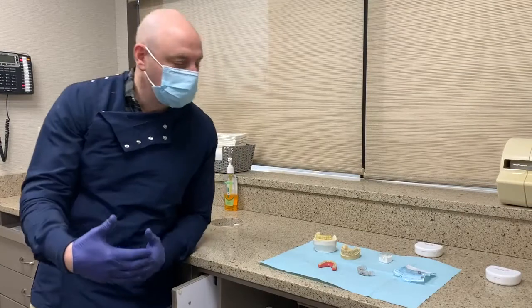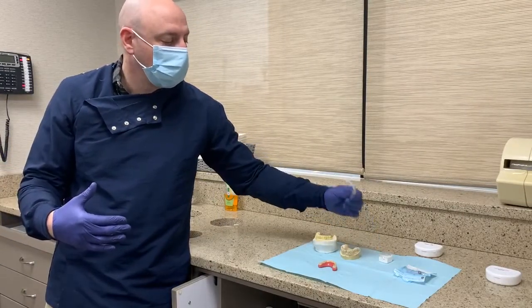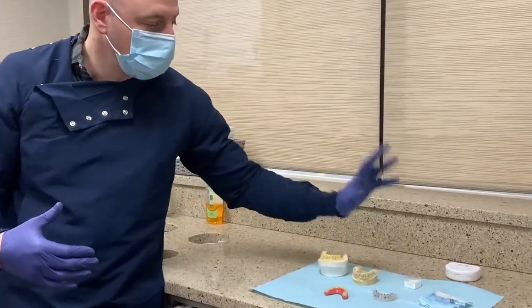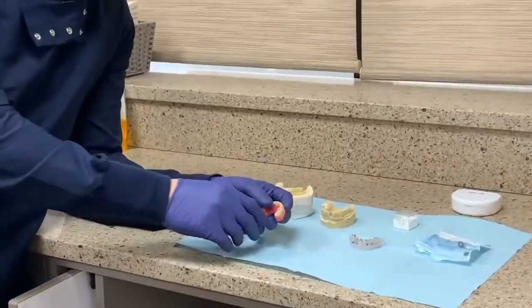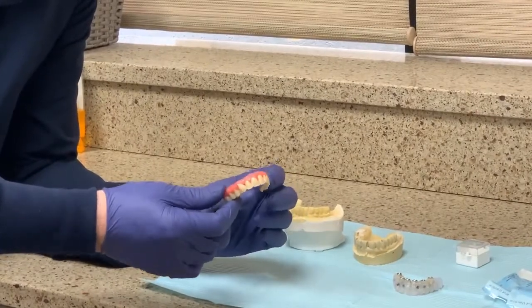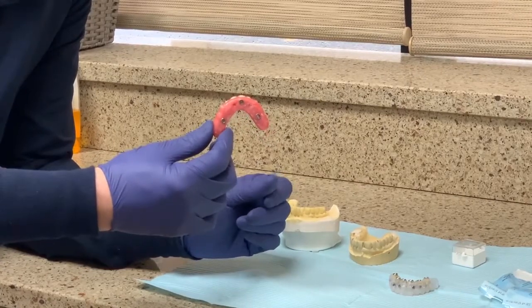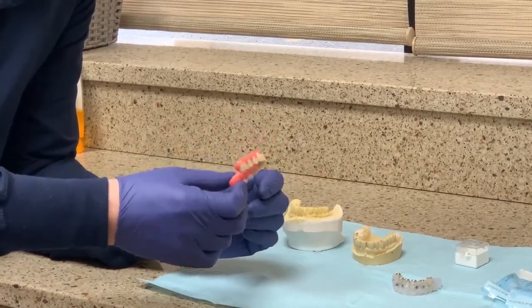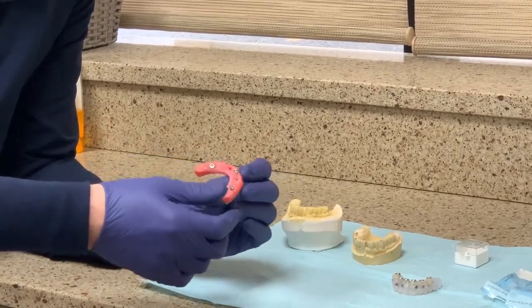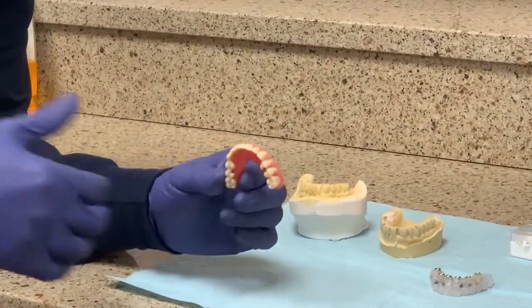So this is the next phase before delivery. Last visit, we took the occlusal record and impression of the soft tissue, and the laboratory in sequence sends us back a mock-up. It's a denture tooth mock-up, which is great, only utilizing 3 of the implants to make a quick try-in. They relieve the area where the other implants are, or the other multi-units are, so it'll fit right over top of those implants.